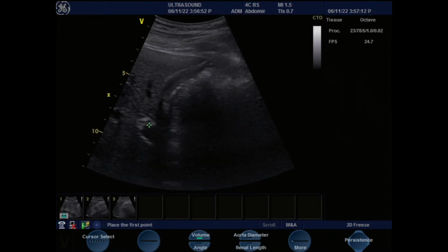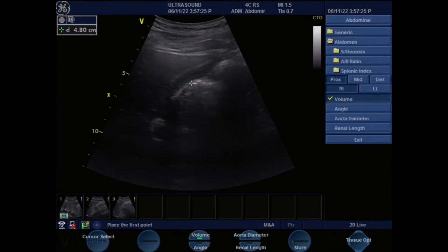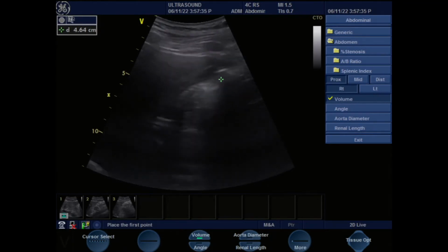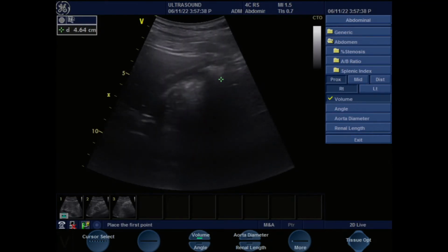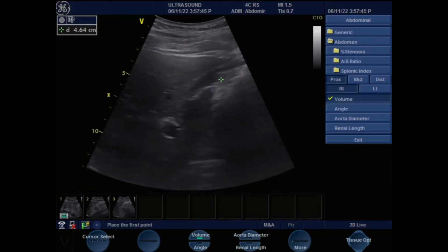So you have stones in there? Depends, most likely yes, depends on the size of the stone and how contracted the gallbladder is because of all this bowel shadowing here. This is all bowel. It's very easy to mistake bowel for stone. So that's why, but you can see it. Do you see it contract in the image, or is it just moving? No, it's not moving, let me turn it on again.